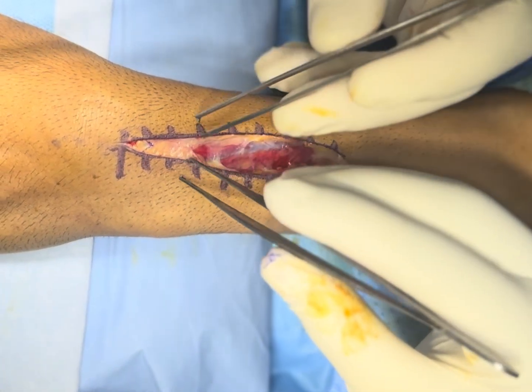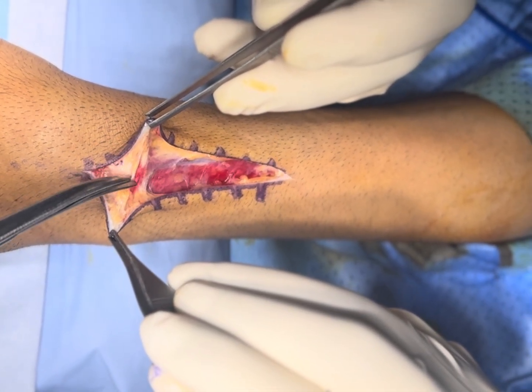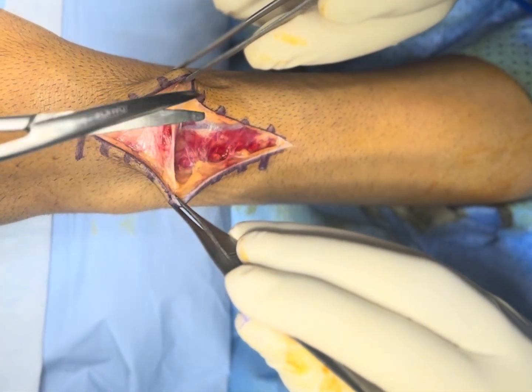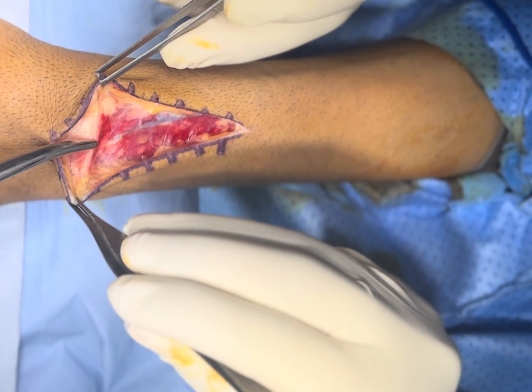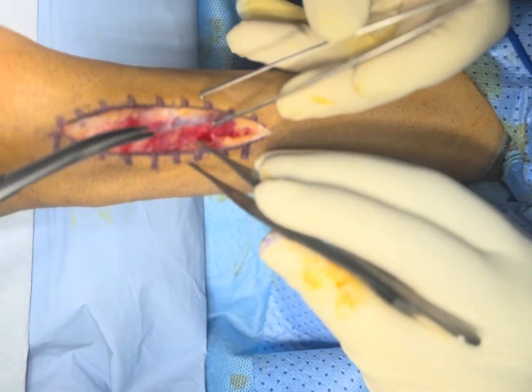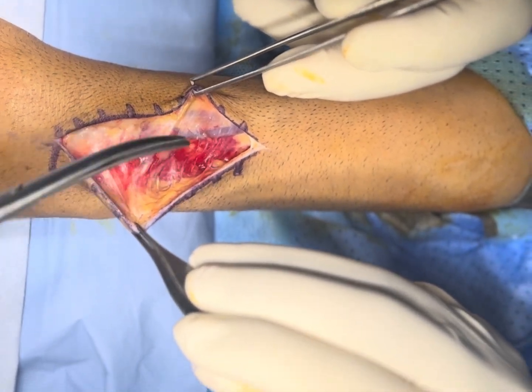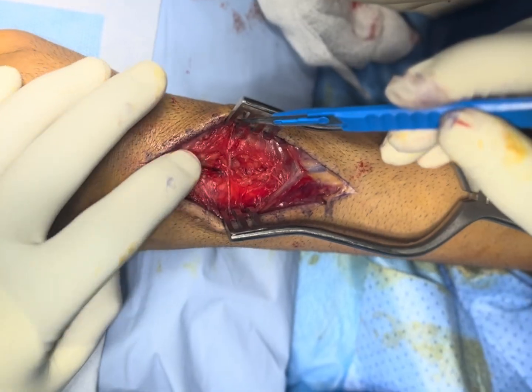You will find some dorsal veins here, so try to protect them as much as possible — if not, then you may have to sacrifice them. Try to create a flap in which the radial nerve comes within the flap itself. We have created the flap and now I can feel the Lister's tubercle easily.